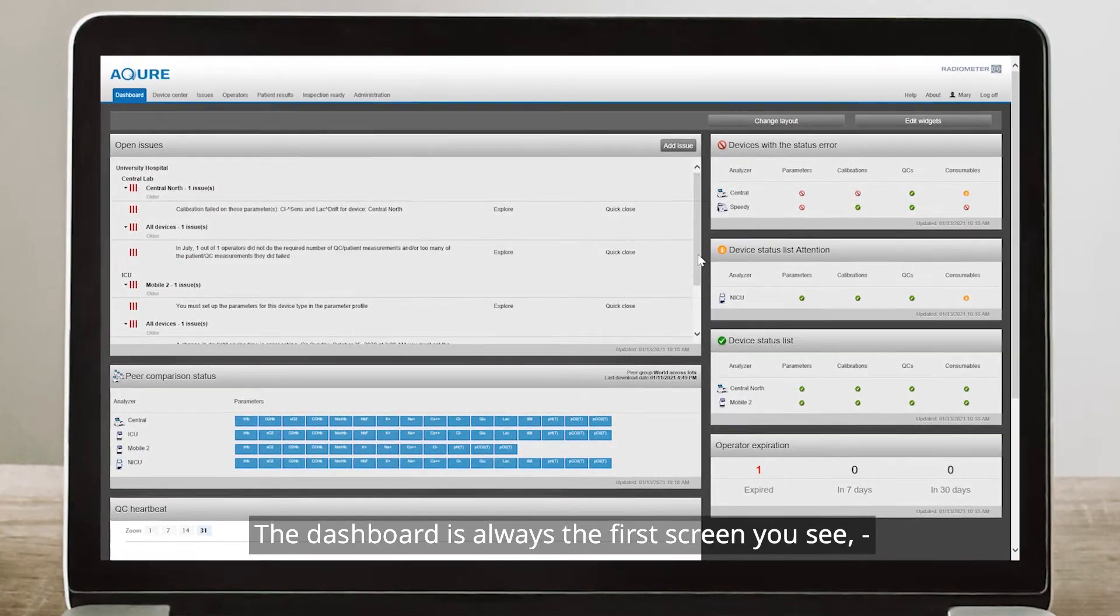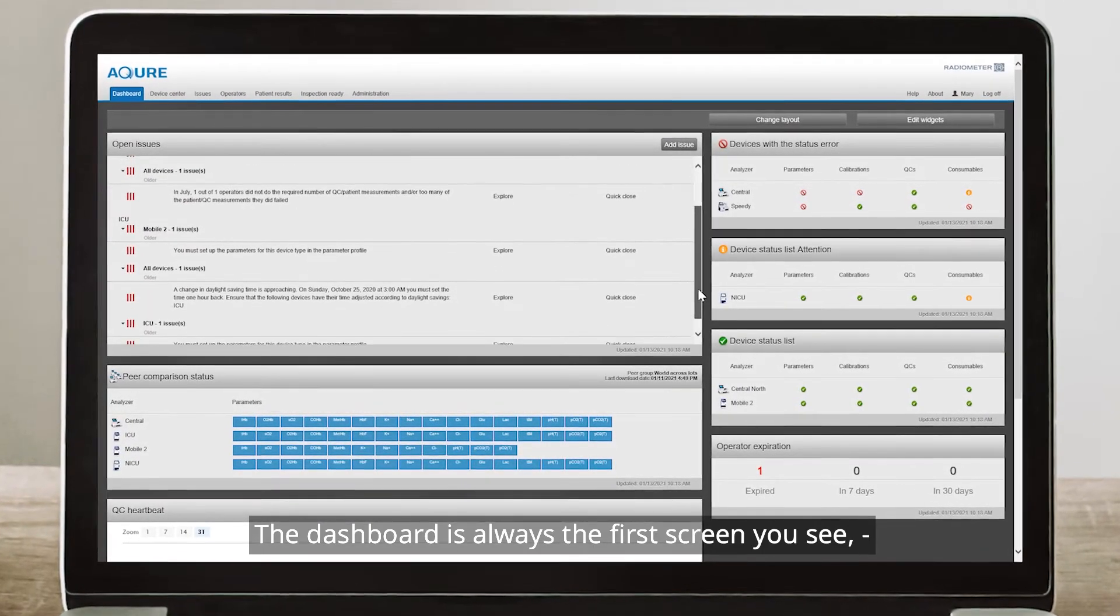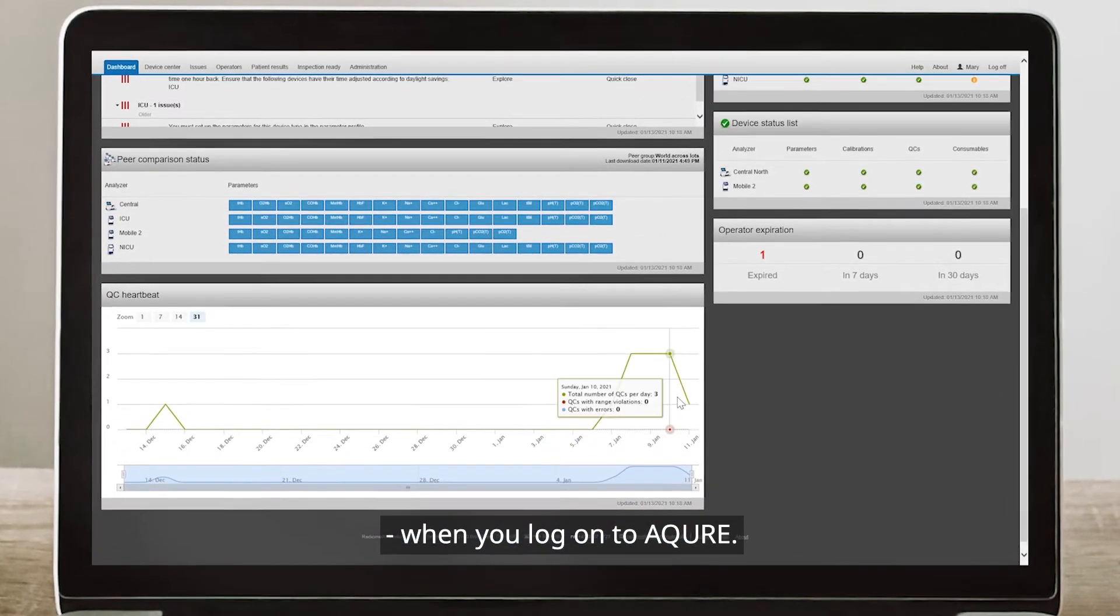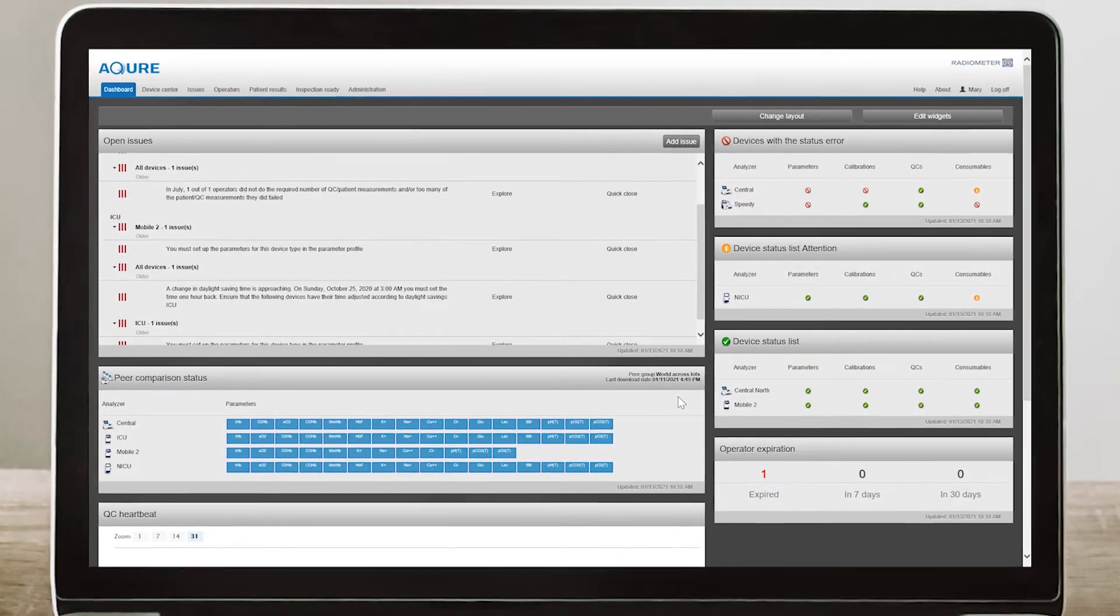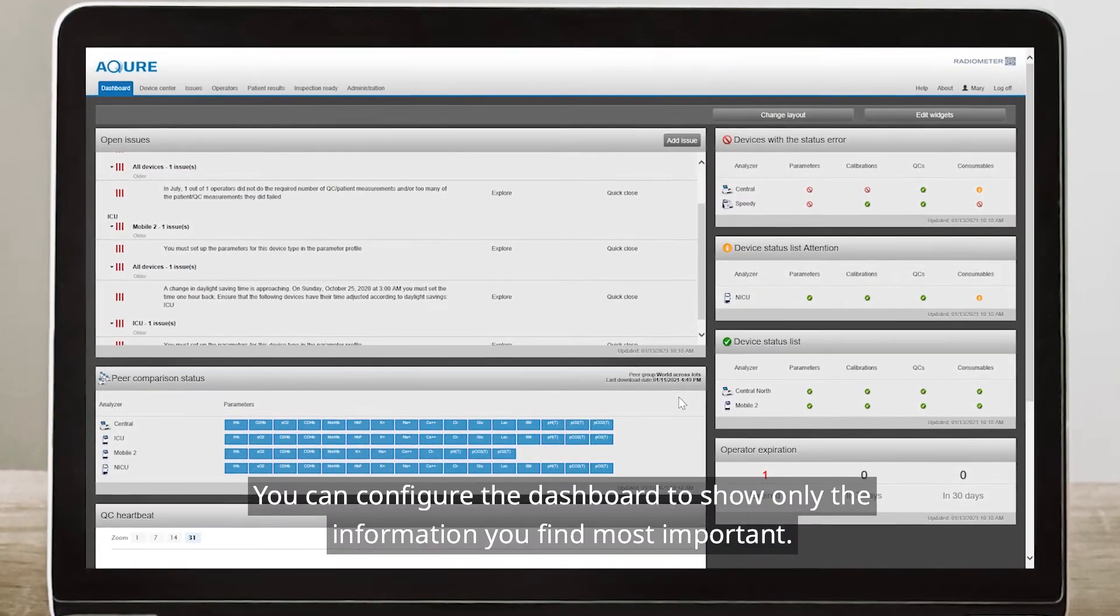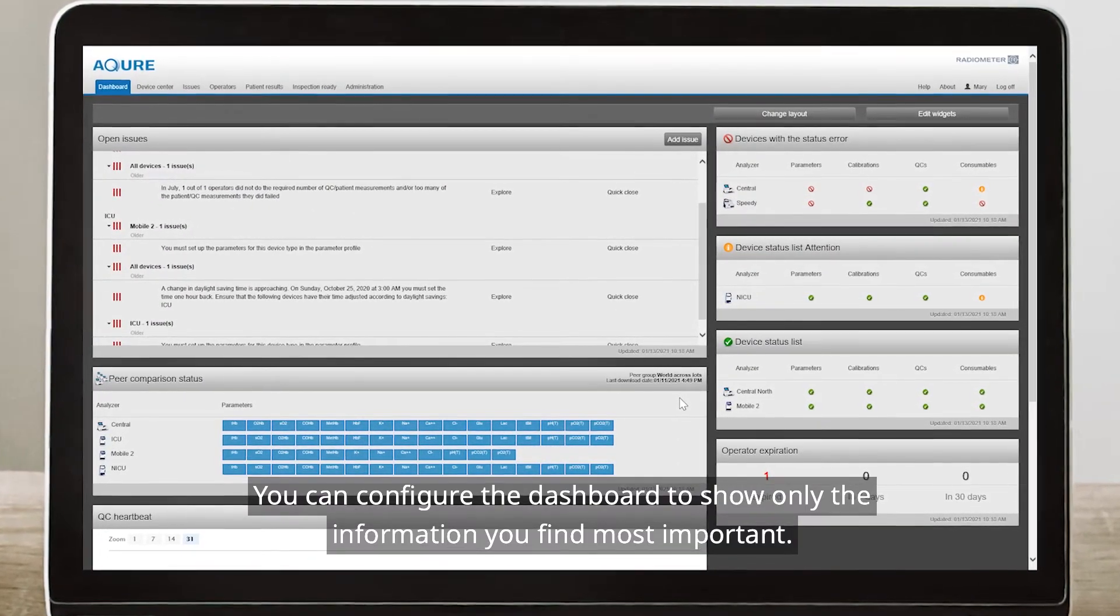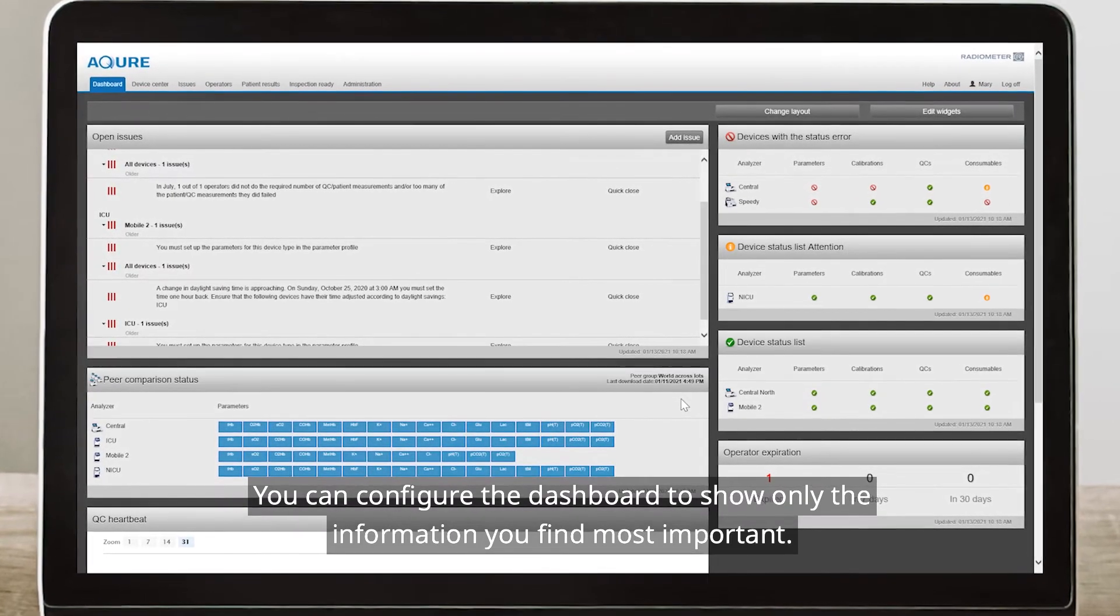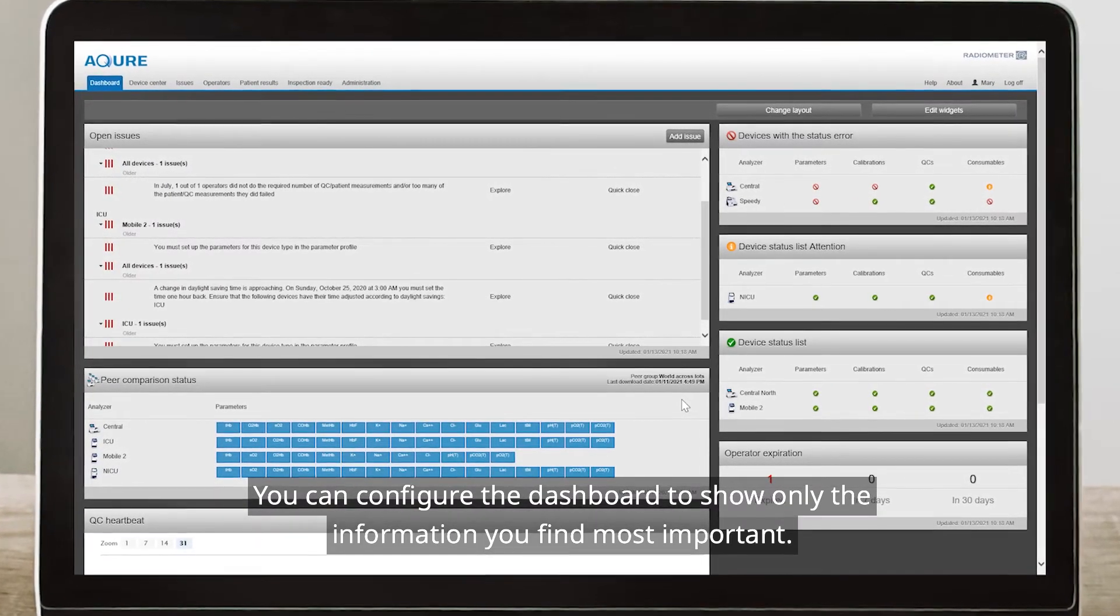The dashboard is always the first screen you see when you log on to Acure. You can configure the dashboard to show only the information you find most important.